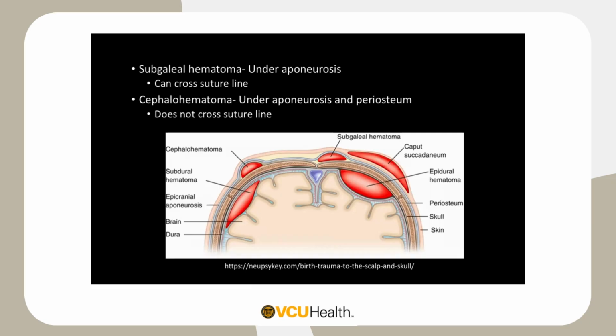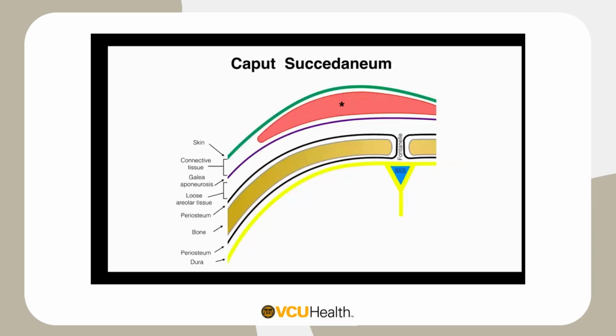To me, it doesn't really matter what you call the hematoma, but sometimes it may matter, just for the sake of looking at it. And then we'll take a look to see the membrane that's either over it, like your galea, or around the areas of your periosteum. So let's just break it down.